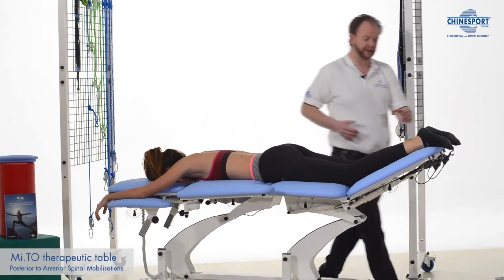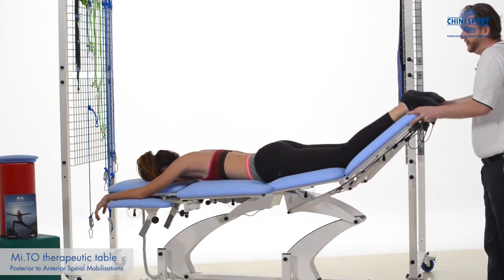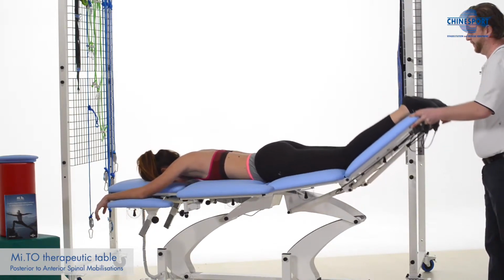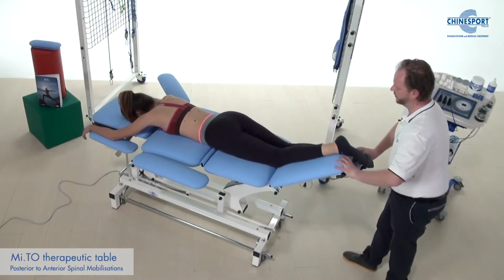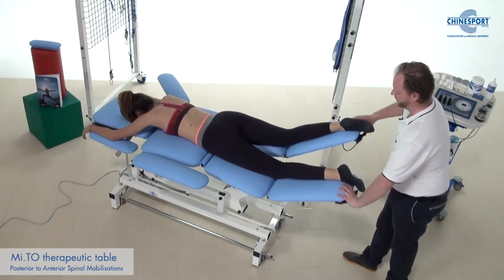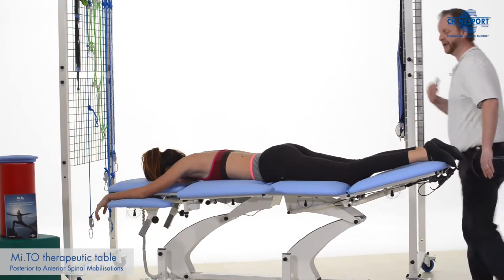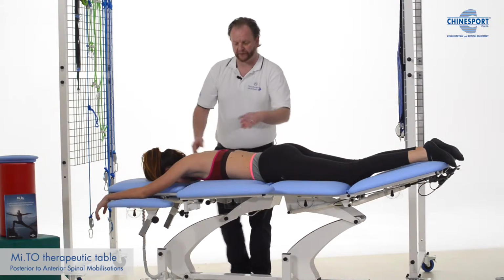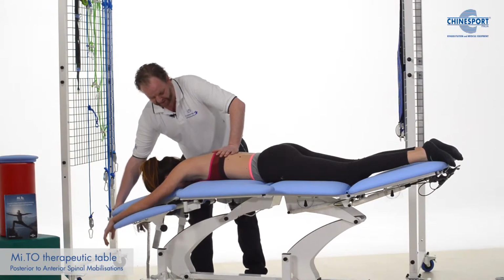Or if that's too much for the patient, we can simply do this also from the posterior side. We can use the pelvis to create that extension. We can also mobilize in this way and create some kinesthetic awareness and some understanding of where maybe some pain is coming from for the patient, and make the patient feel more at ease with the pathology. We can go further with the extensions into the thorax, where we're moving this segment.